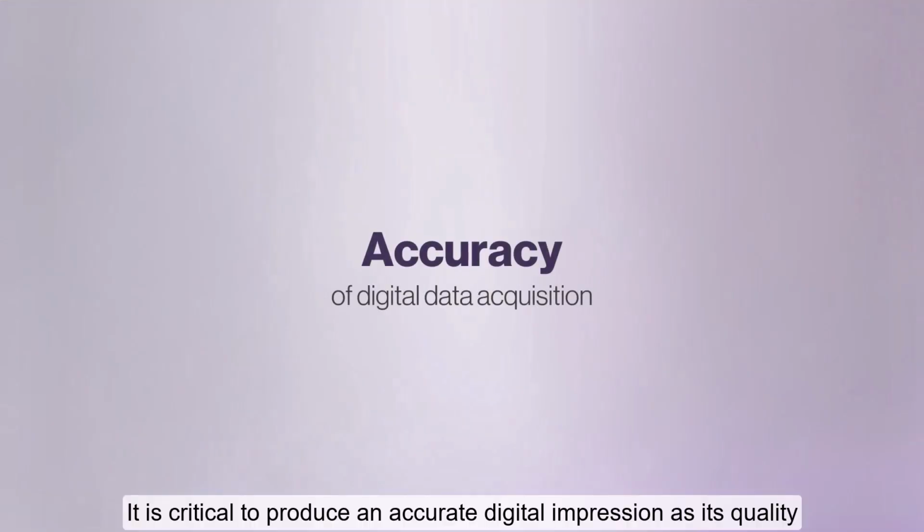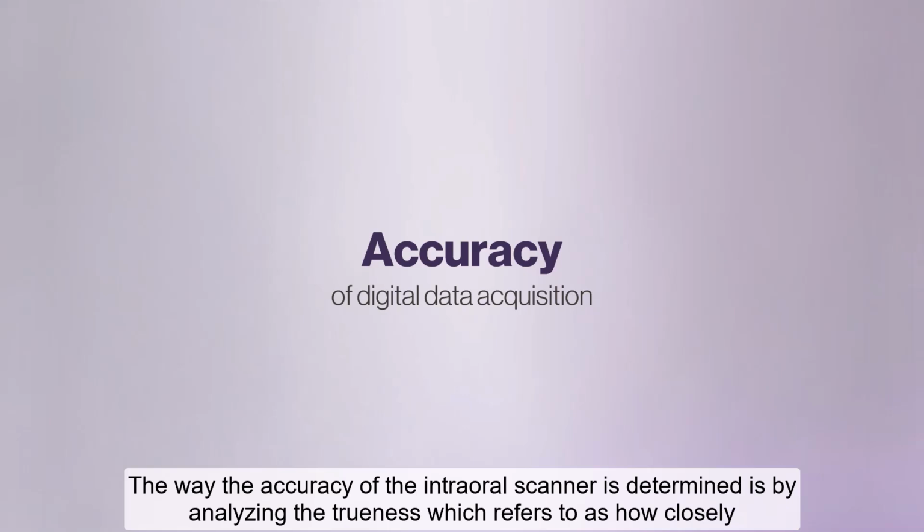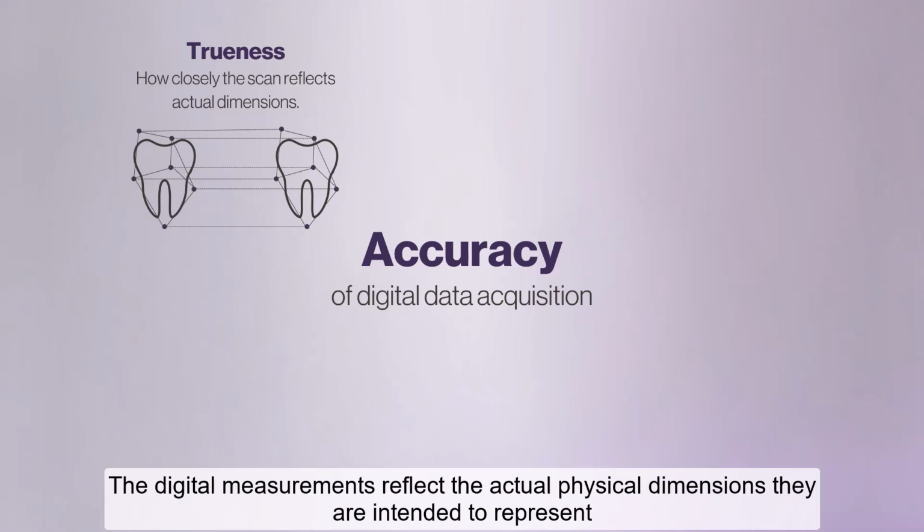It is critical to produce an accurate digital impression, as its quality directly influences the fit of restorations produced by the laboratory. The way the accuracy of the intraoral scanner is determined is by analyzing the trueness, which refers to how closely the digital measurements reflect the actual physical dimensions they are intended to represent.